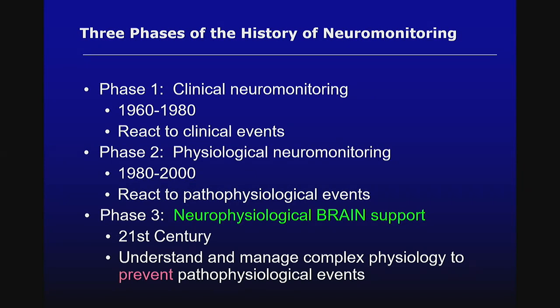And in addition to giving us signals, like when the needle's in the red zone and it triggers an alarm and we react, what I've come to understand is using these devices, we can create and establish and maintain an optimized physiologic environment for the injured brain. Perfused optimally, fed with glucose optimally, sedated when there's abnormal increases in metabolism and electrical activity like seizures. And the idea, right, salted, whatever it needs to be, the idea is to optimize that physiologic environment and to prevent the ICP wave from ever happening at all.